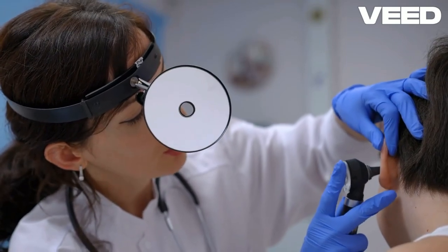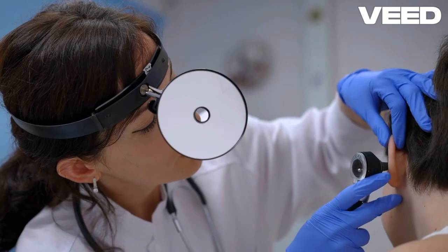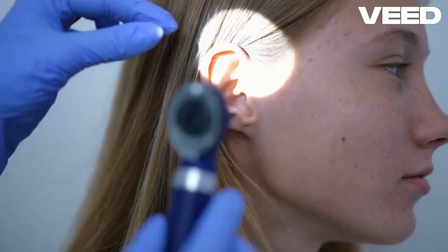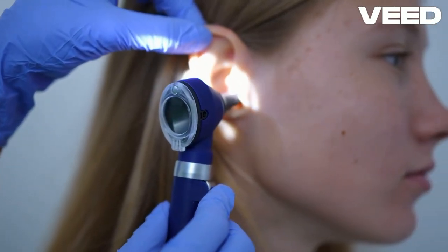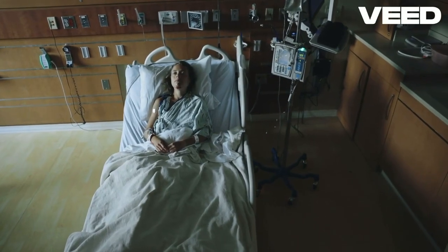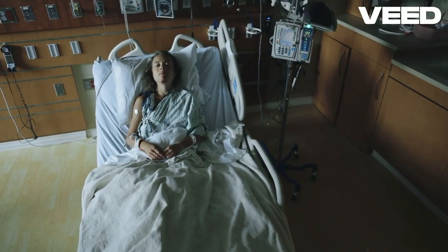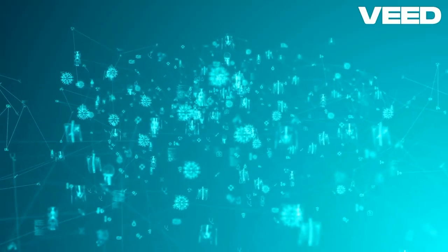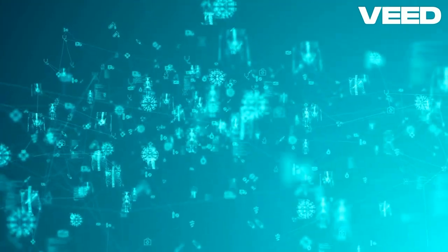The procedure starts with clearing the ear canal and mastoid cavity of any disease or debris. The choice of obliteration materials includes autologous options like bone pate, cartilage, fat grafts, or temporalis muscle flaps, and synthetic materials such as hydroxyapatite or bioactive glass. The obliteration material is placed in the mastoid cavity to fill the space and stabilize the structure, sometimes accompanied by reconstruction of the external auditory canal.